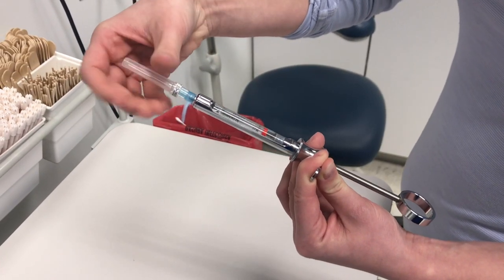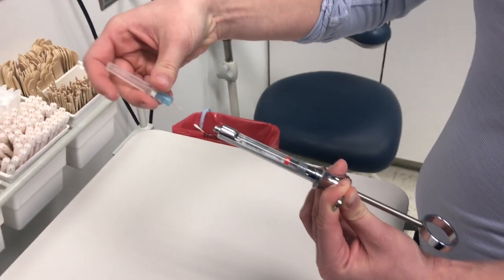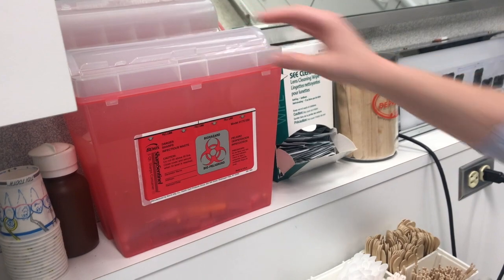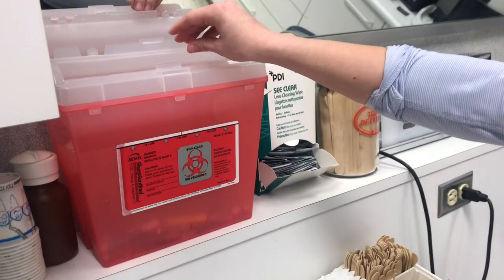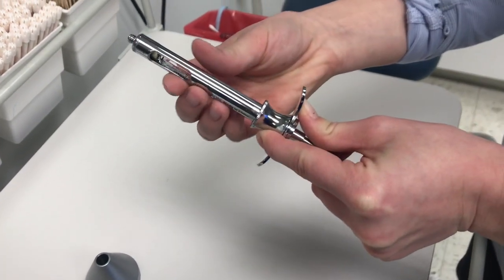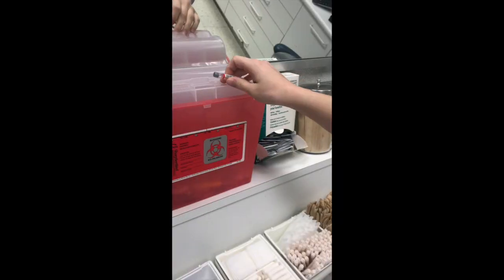Unscrew the needle and place it in the sharps container. Pull back on the thumb ring and remove the cartridge, then throw the cartridge in the sharps container.